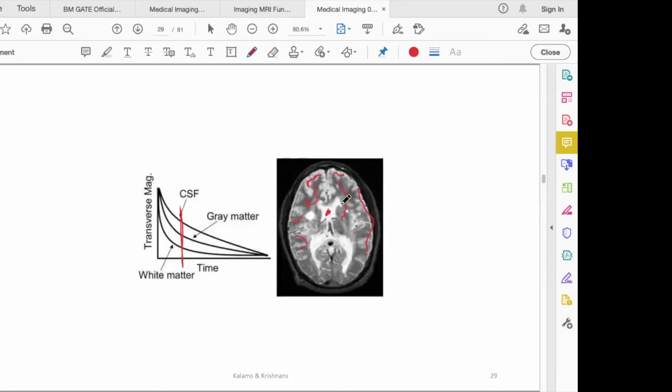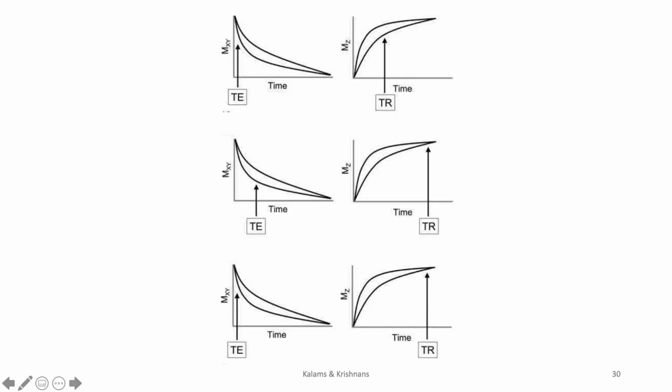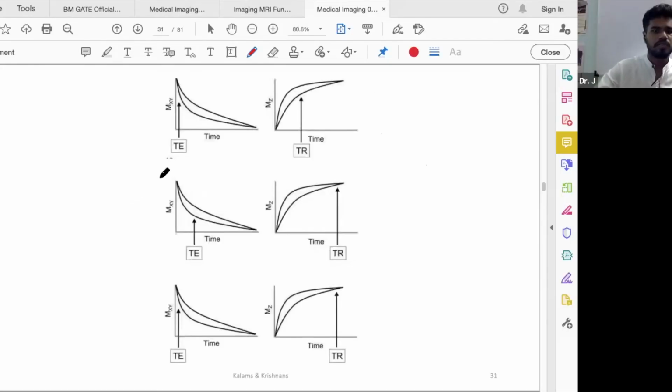Okay. So let me proceed further. Now, we will finish with this particular slide. Here is the thing. So now I am going to introduce two parameters. Let's say you're a photographer, you have shutter speed and aperture in the camera, or you are cooking something, the amount of time that you cook, make an omelette, whatever it is, or a soup. So the cooking time is one of the parameters, let's say T, and there is one more parameter during cooking, say the vessel you use or whatever. Again that's a time. Okay, so we have two parameters to control this MRI process.